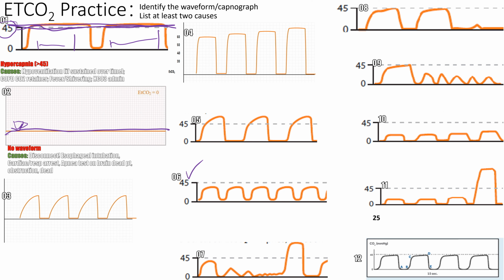Okay, and then number 3. It's like a pretty pronounced shark fin. Yeah, so there's a classic shark fin. See how that angle is different than this angle, right? The number 4, right? So that is a shark fin appearance. So what does that tell us that's going on?